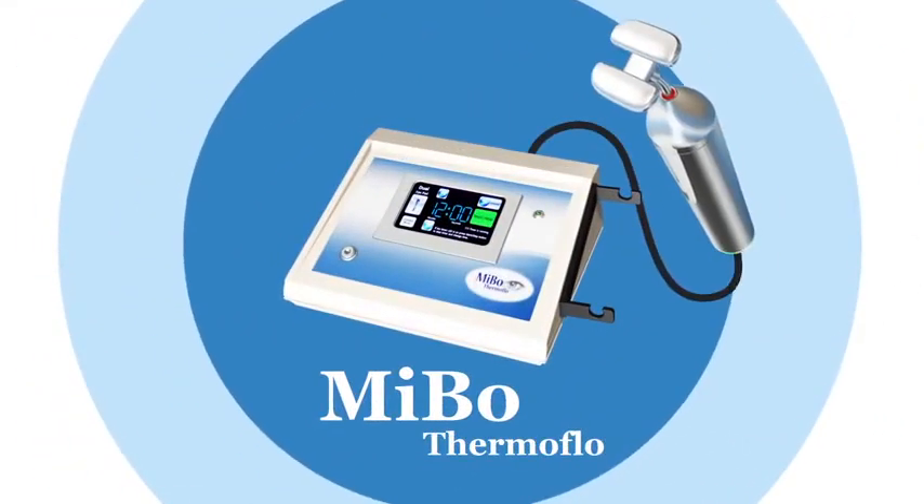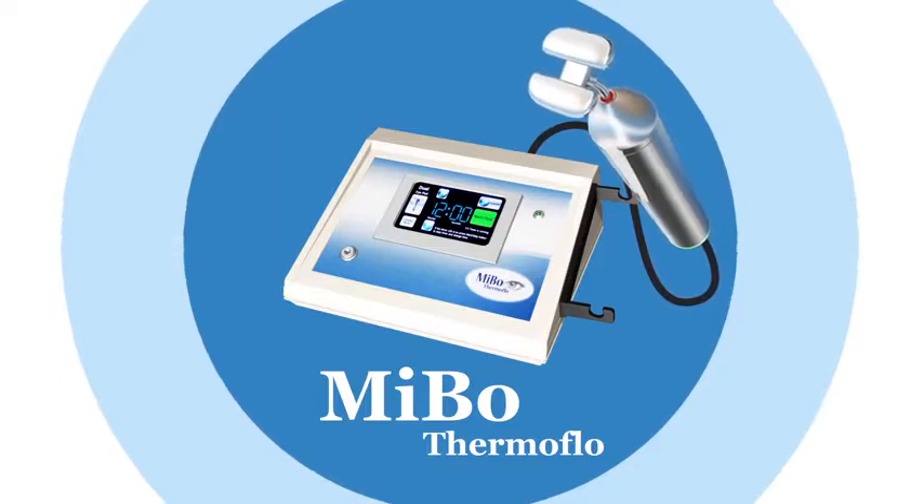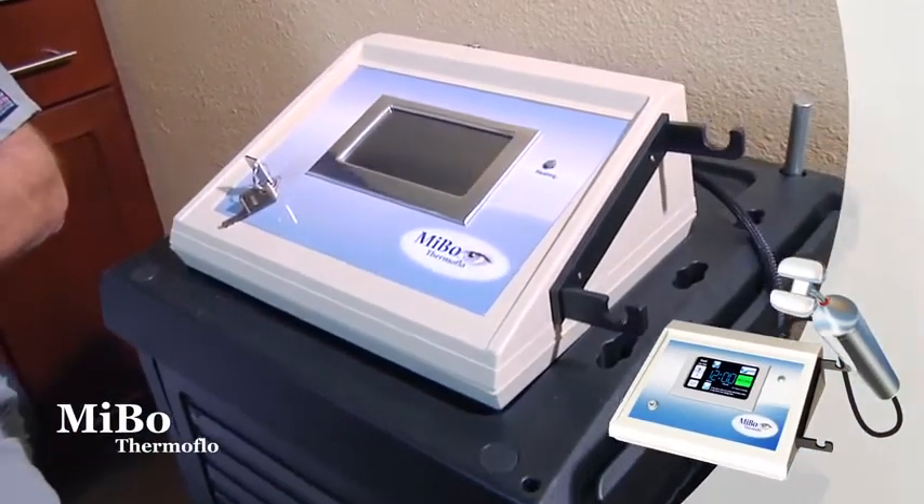In this video, we'll cover the proper technique for effective treatment, comfort for you and the patient, and operation of the device.